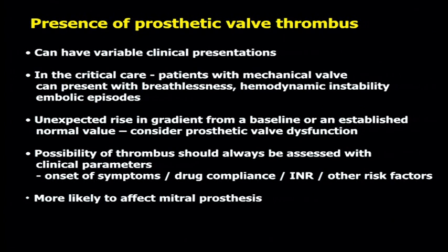So to conclude, presence of prosthetic valve thrombus can have variable clinical presentations. They can present with breathlessness, hemodynamic instability, they can present with embolic episodes. So what is important to note is that whenever they come with a history of mechanical valve, one has to compare the gradient.